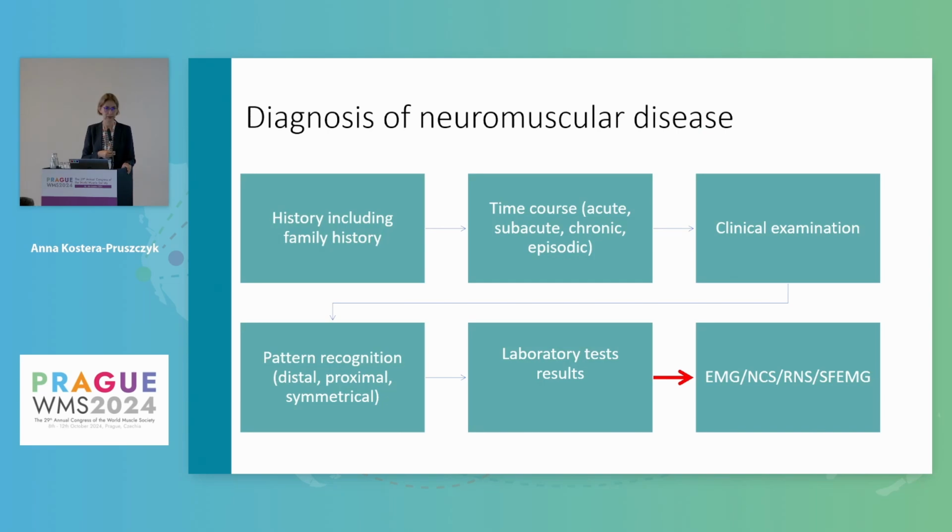EMG has changed its place in the diagnosis of neuromuscular diseases.